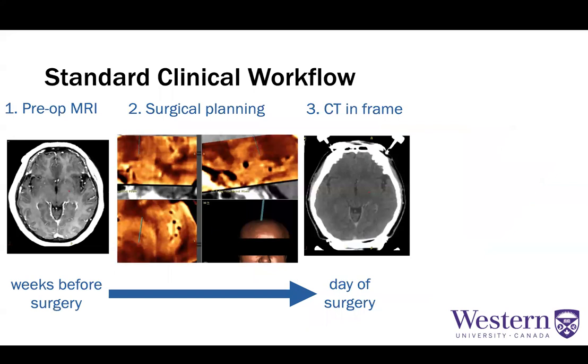Now, what is standard still to this day is performing a preoperative MRI in the weeks to days before surgery, then planning the procedure in the days before surgery, and then on the day of surgery, typically providing a scalp block and then getting a CT with the patient in a frame.